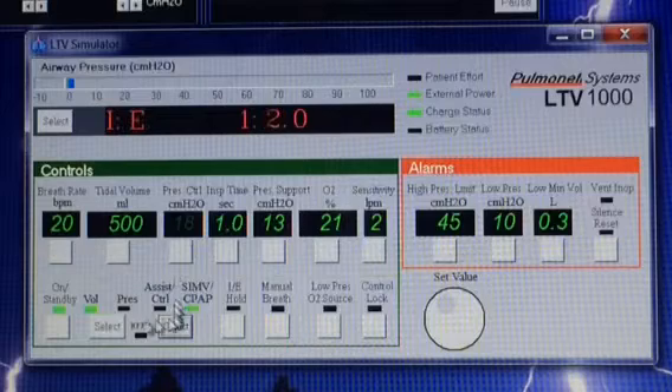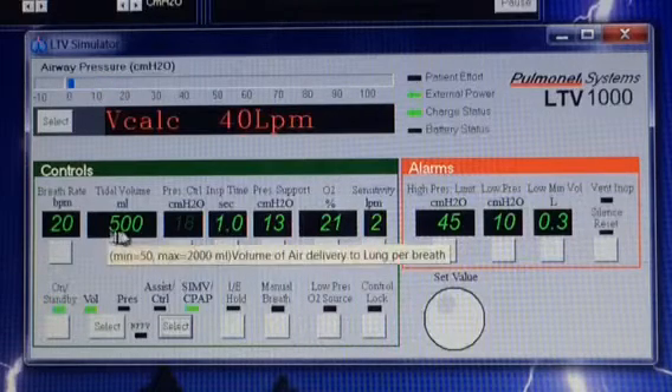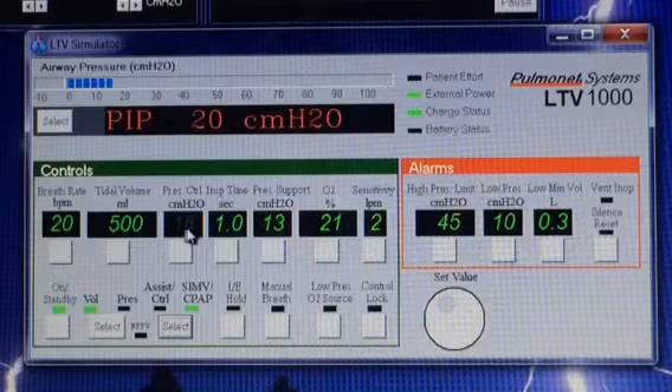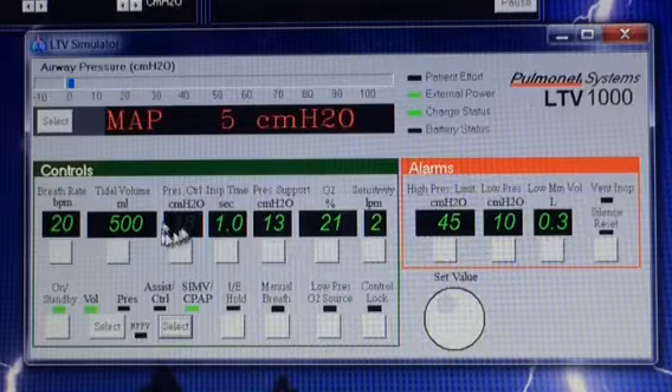In this instance, we are on a volume-type breath. So the volume is highlighted, but the pressure control is dim — that means it's inactive and we are not going to chart it. It doesn't matter what this says.